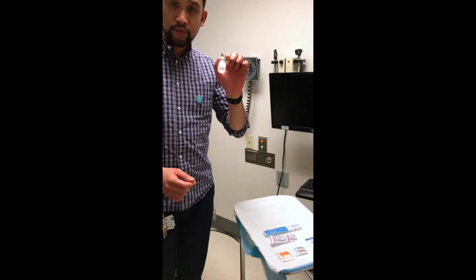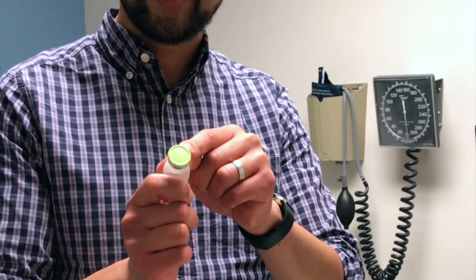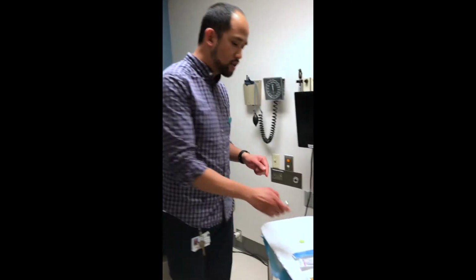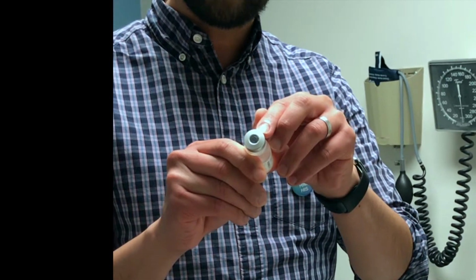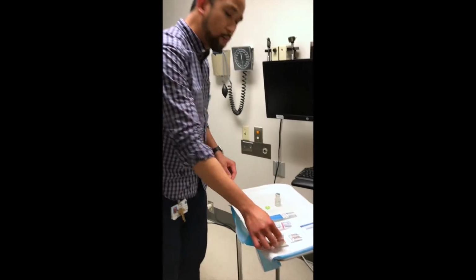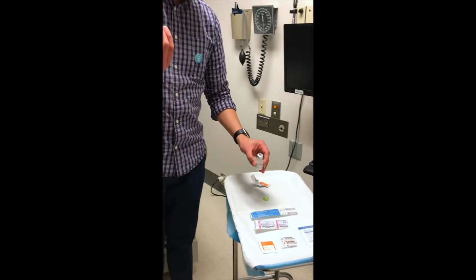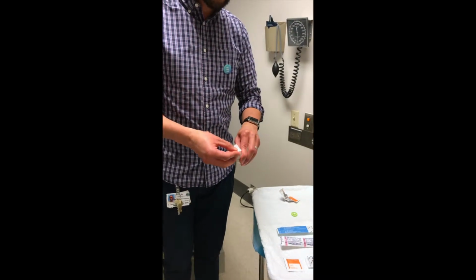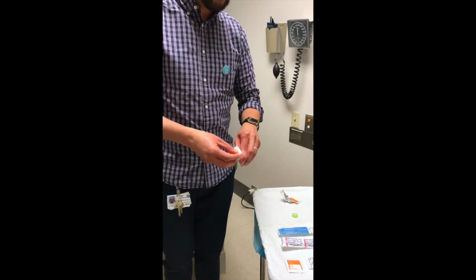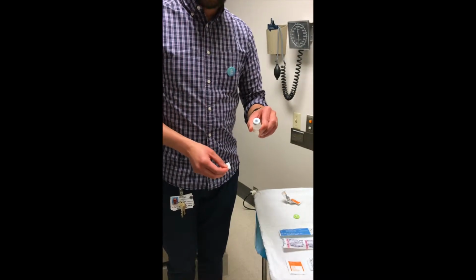So we'll use normal saline. Your vial should come with a plastic cap on it the first time you get it from the pharmacy. The first thing you do is just pop that open, and it exposes this rubber stopper. It's usually gray in color. What you'd like to do is grab one of your alcohol swabs, tear that open, and then use the alcohol swab to scrub vigorously on the rubber stopper to make sure whatever bacteria is on there, you're scrubbing it off. And you let that dry.